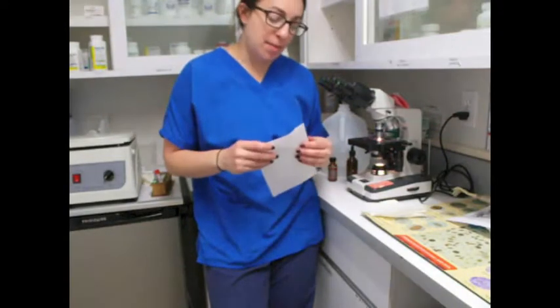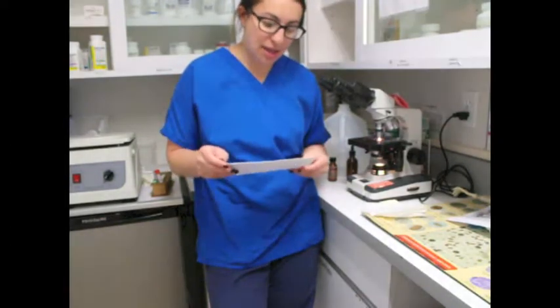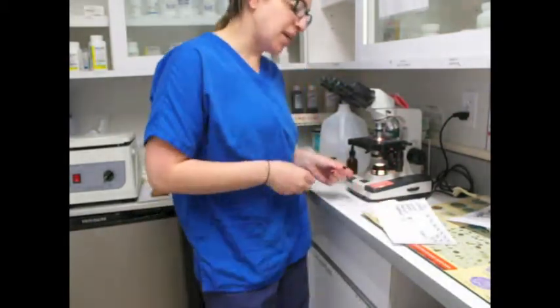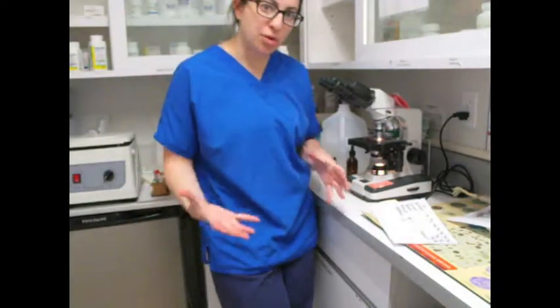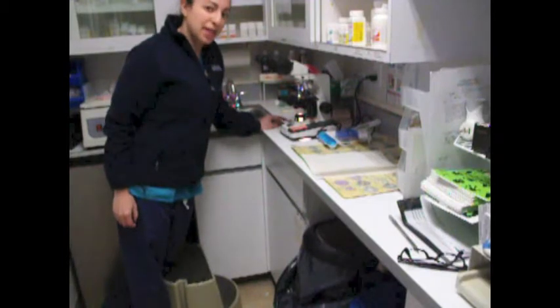So now, from here, you want to know any abnormalities that you saw, anything out of the ordinary. I did not see any abnormal cells on this slide. I am next going to look at the platelets and see if any of them appear abnormal. On this slide, there are a large number of platelets, so I'm going to go ahead and start my count there.